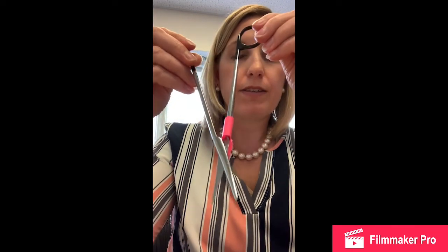P is Metzenbaum scissors, okay? These are used to cut tissue, most commonly used to cut adhesions, but other kinds of tissue as well. They are fine scissors that should ideally be very nicely sharpened to give you a good cut of tissue, okay? They should not be used for suture. They will dull very quickly with that. So please be kind to your techs and to your instrument processors and for your future self when you grab a pair of these and just use them for tissue, not suture.